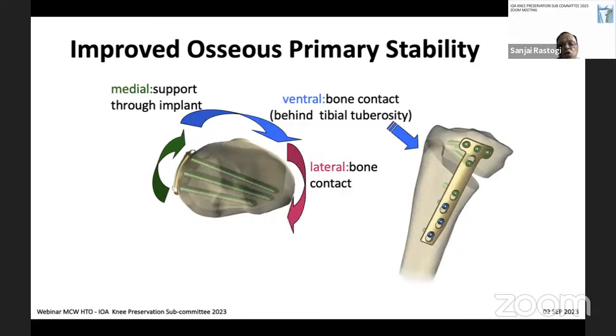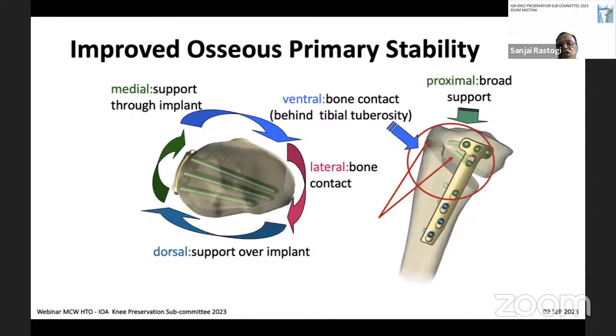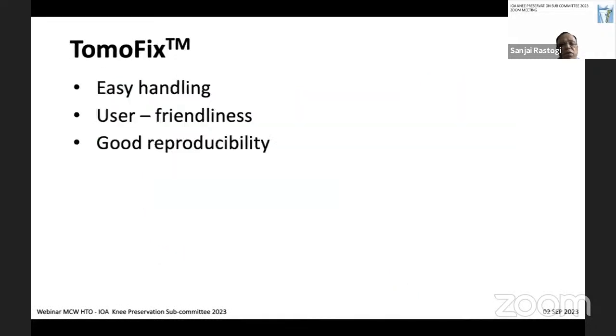Laterally, the hinge is already there. Posteriorly, the screws are directed posteriorly, so they support the posterior part, and the proximal support is there because there are four locking head screws in the proximal part. So this is the area where there is bone contact even after the osteotomy because of the biplanar nature of the osteotomy. Tomofix per se is very easy to handle if you understand the implant and the technique. It is user friendly and good reproducibility is there.